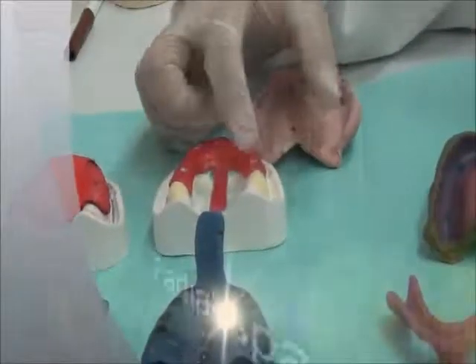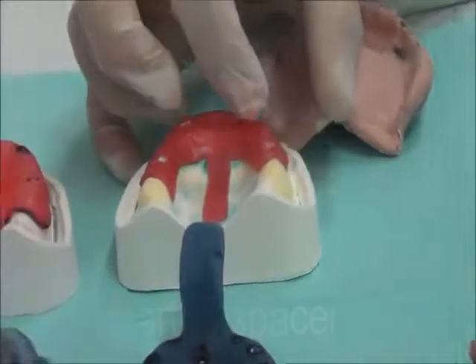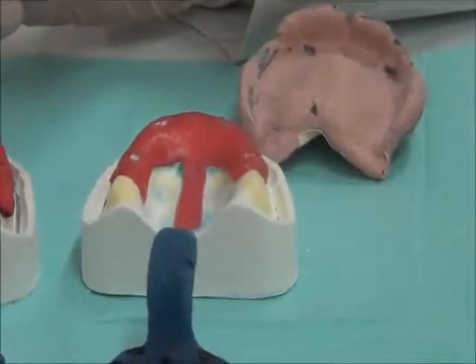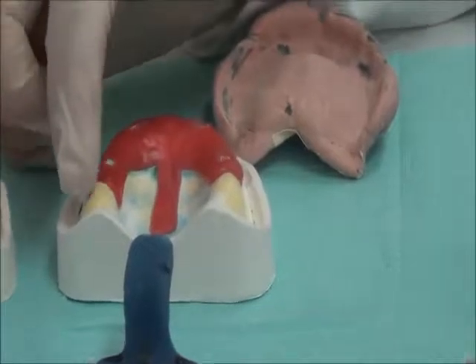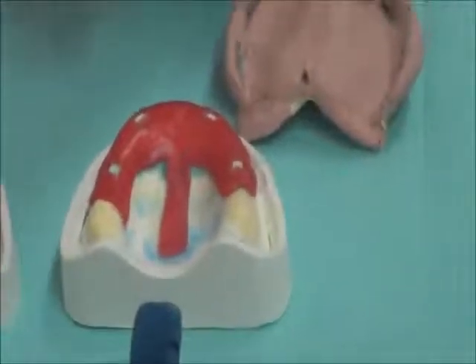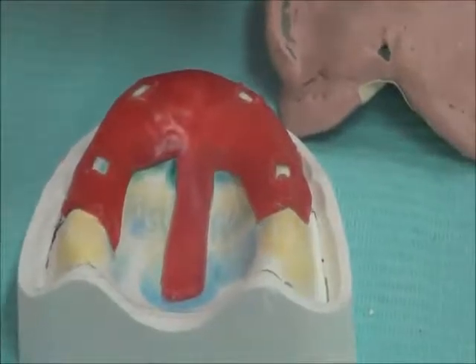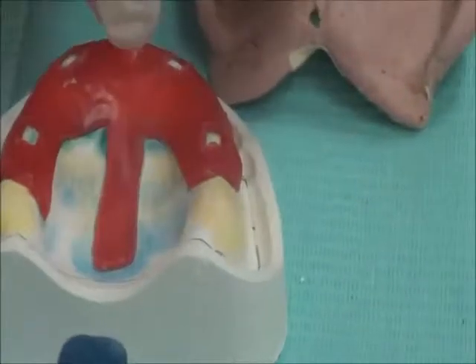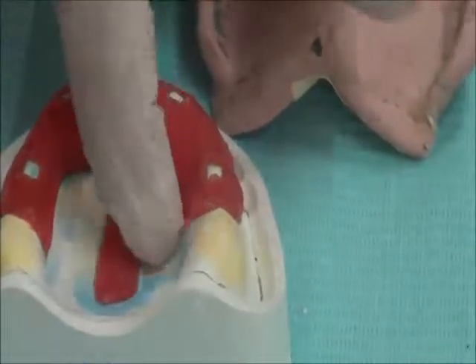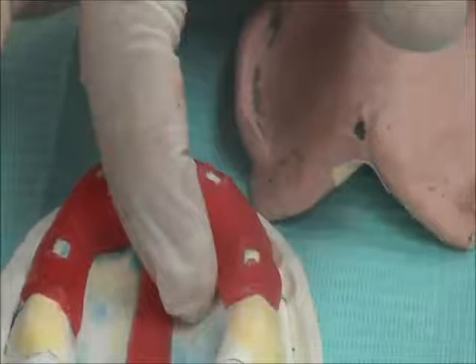What about partial spacer? Partial spacer means that I'm placing the spacer in areas we call relief areas, areas that we should not exert pressure on for many reasons, while the areas without any spacer will have the tray closely fit to the tissue. So in these areas, the impression material will be squeezed between the impression surface of that soft tissue and the tray. So this area will be firmly compressed. These areas are firmly compressed, and these are called support areas.